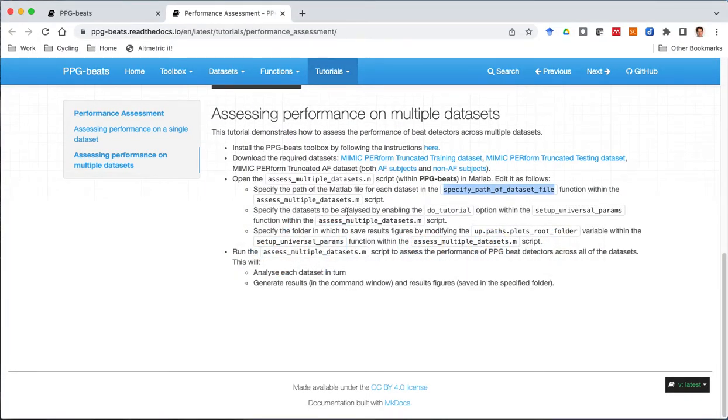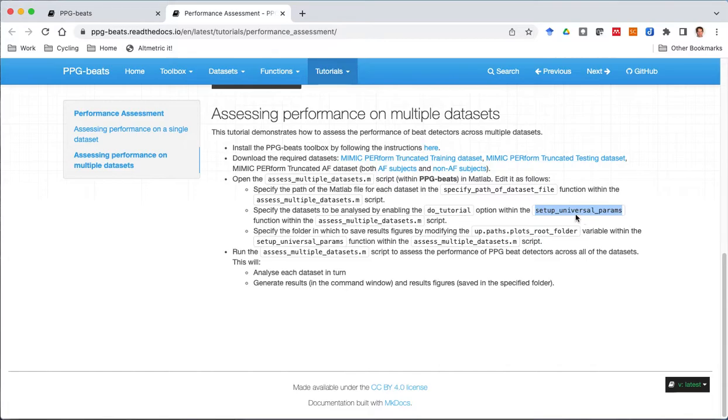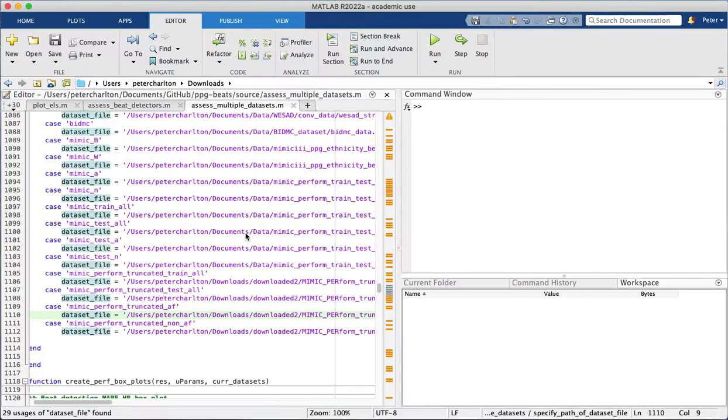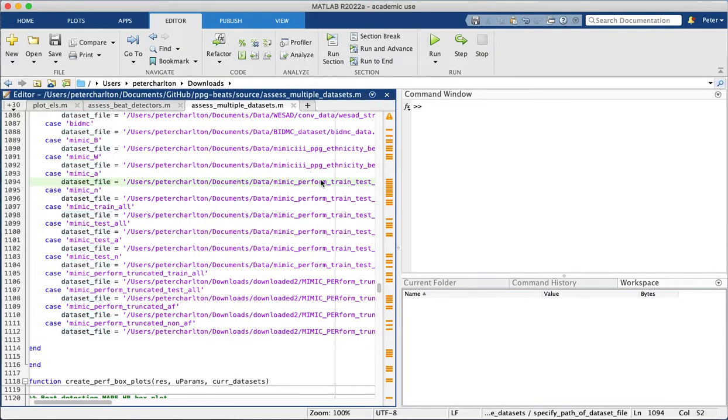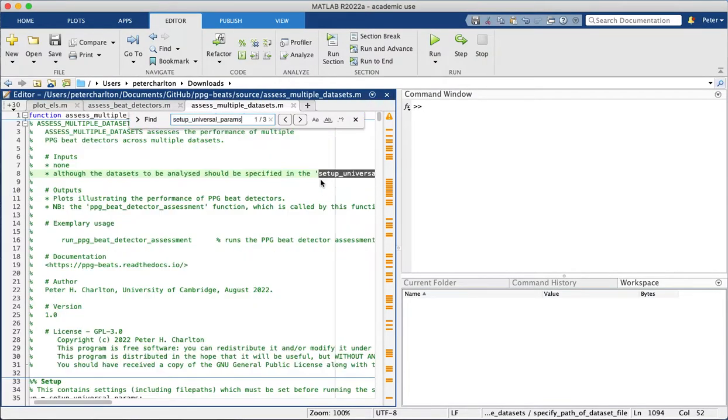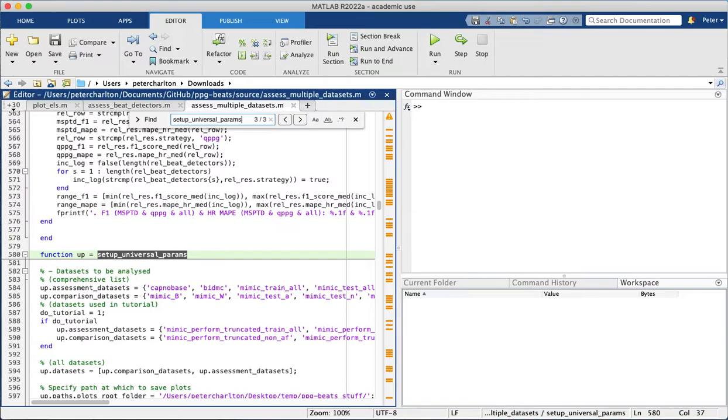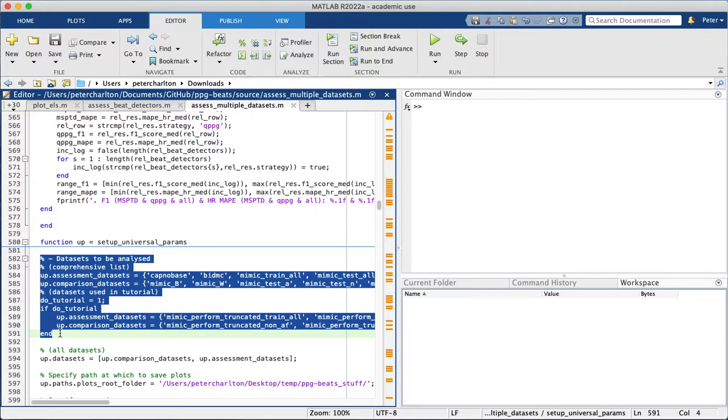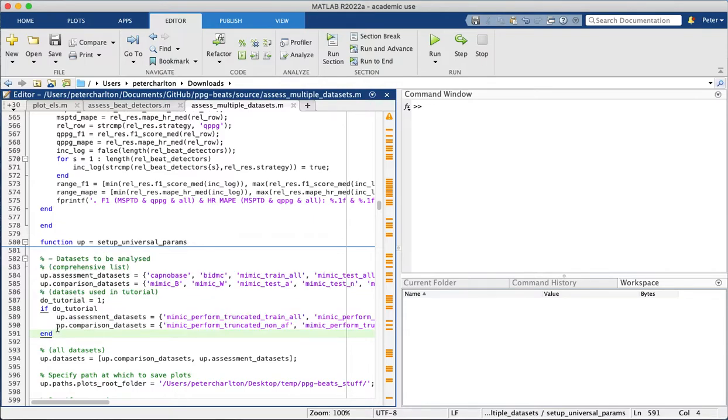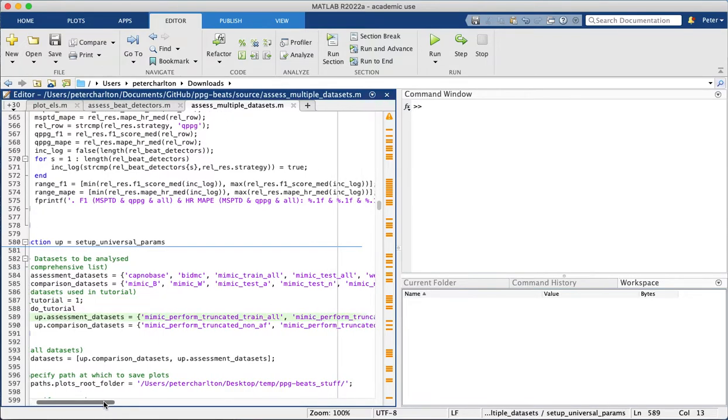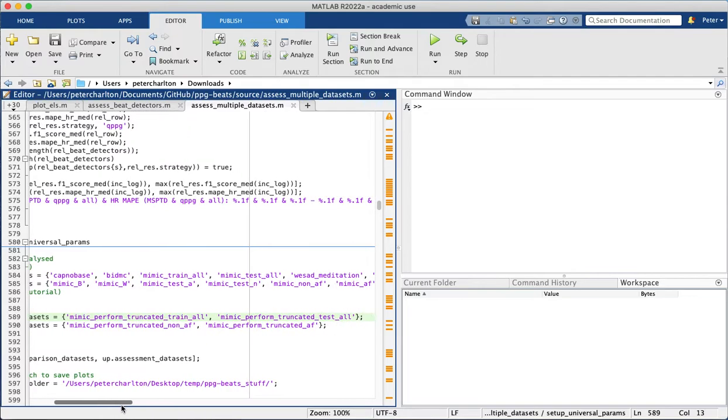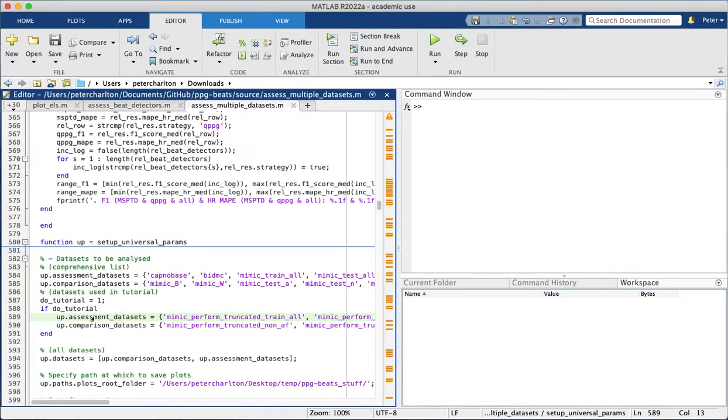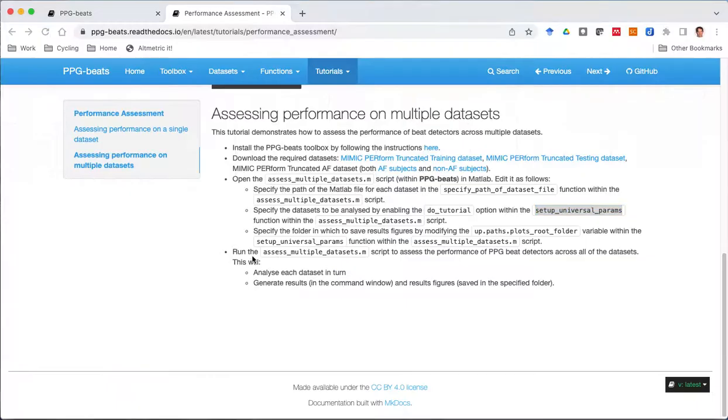The second step is to specify the datasets that we want to analyze, and that's done within this setup the universal parameters function. So let's have a look at that. Okay, so this part here specifies the datasets to be analyzed. And there's this flag which allows us to specify these datasets here, which are the four that we have downloaded. So as that's set to one, that will analyze those datasets.